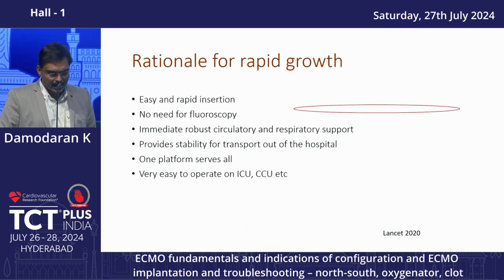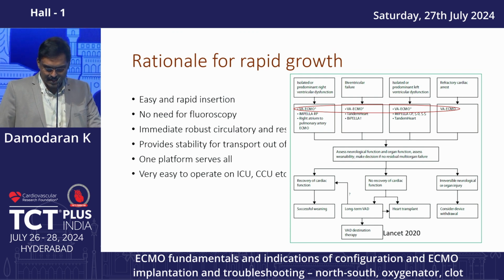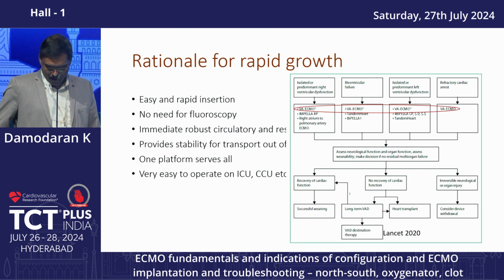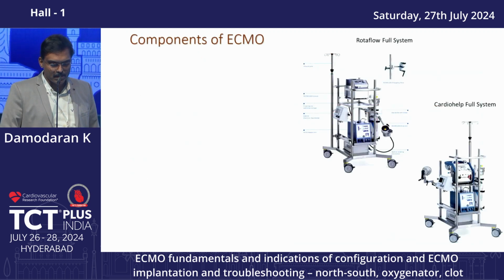Why should there be a rapid growth? Because it is an easy to insert device. There is no need for any imaging guidance. And more than anything else, it is one platform that serves all. The latest Lancet 2020 suggests that ECMO can be used in all forms of ventricular dysfunction, whether isolated, biventricular, or a witnessed cardiac arrest. So it's a very wonderful device that all cardiologists must be familiar with.